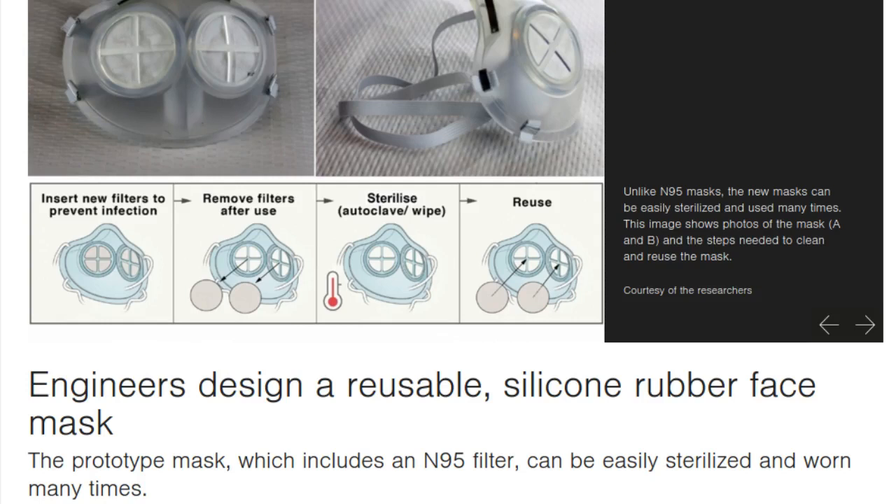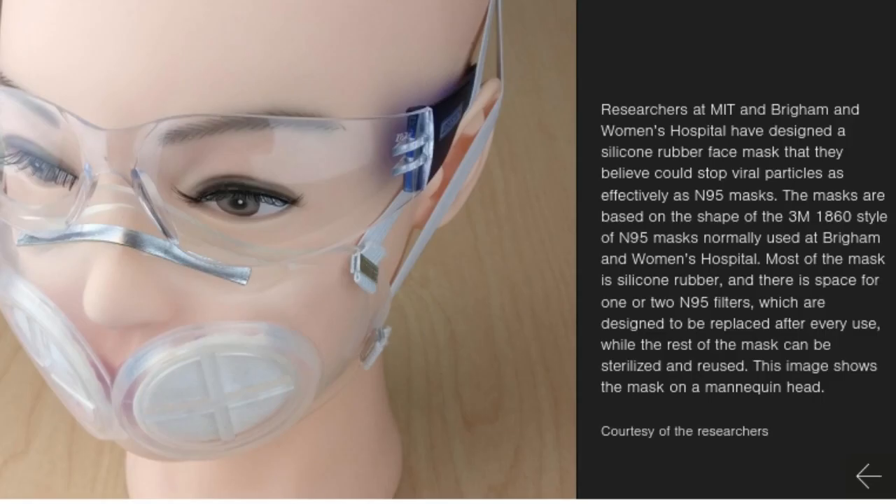Researchers at MIT and Brigham and Women's Hospital have designed a new face mask that they believe could stop viral particles as effectively as N95 masks. Unlike N95 masks, the new masks were designed to be easily sterilized and used many times.